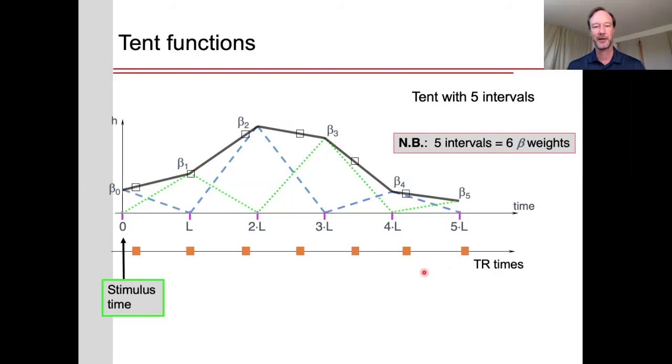The benefit of this kind of way of estimating is that even if our data acquisition is not exactly synchronous with the times at which we want to estimate this hemodynamic response, we can still estimate this. For example, consider the data point right here, acquired at this point in time. We're modeling it with a sum of these 2 triangle functions. And the sum of these 2 triangle functions exactly provides us this particular line between the beta 2 and beta 3.